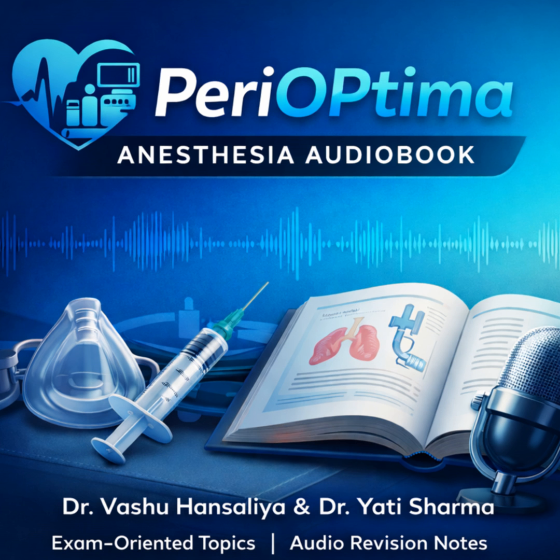Correct. Now, moving on to second-generation SGADs, this is where the innovation really leaps forward. These devices are defined by incorporating critical features that are intended to enhance both performance and, crucially, safety. Okay, what are we looking for? We're specifically looking for two innovations: an improved higher-pressure seal and, the crucial inclusion of a gastric drainage channel, a GDC. This is to actively reduce the aspiration risk. The GDC, that sounds like the conceptual line in the sand. It's trying to functionally separate the respiratory and GI tracts, which was kind of the Achilles heel of the first generation.